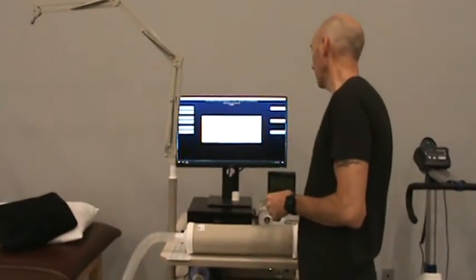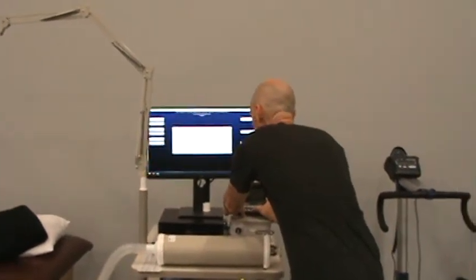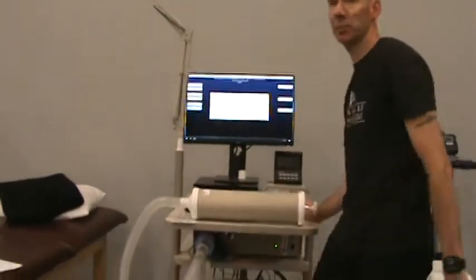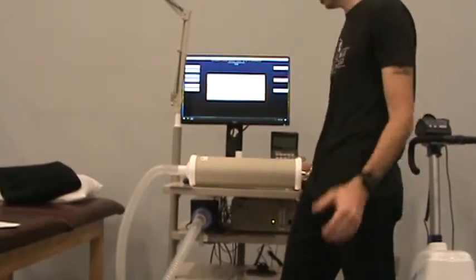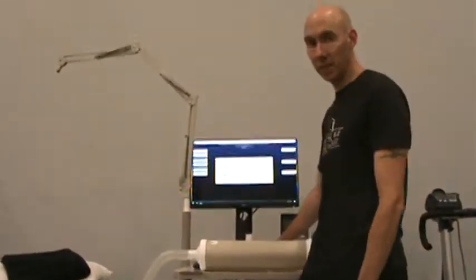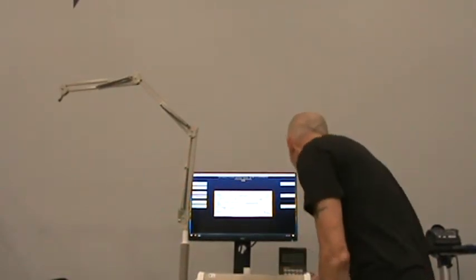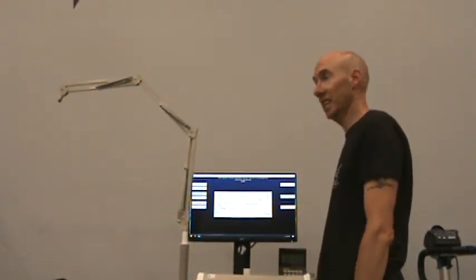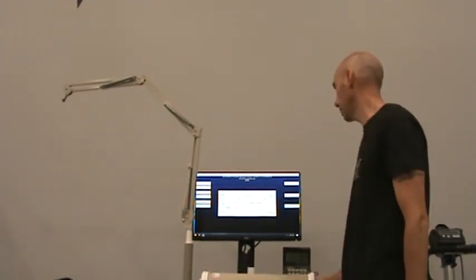And then lastly, the relative humidity today is 66%, which is a huge difference from the last time we calibrated this cart when it was 17%. It has been raining a lot. It is currently May as we're making this video, so it is getting humid here in the city of Louisville. That still seems very high though, 66%. That might be the highest I've ever seen. Okay, so once we have the environmental conditions in, click OK.